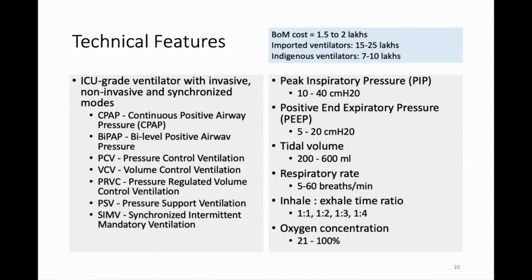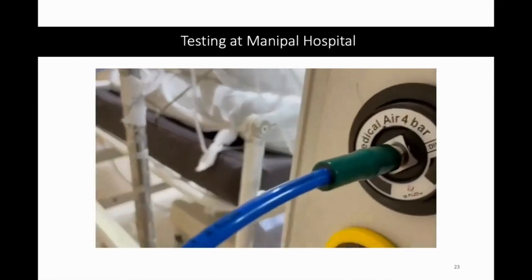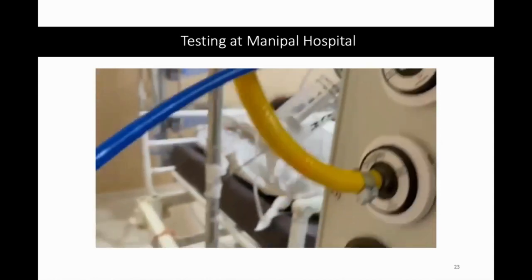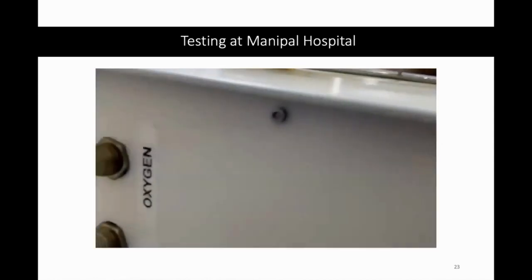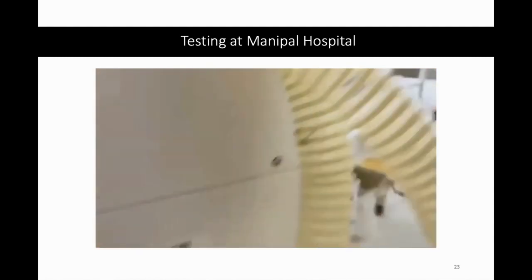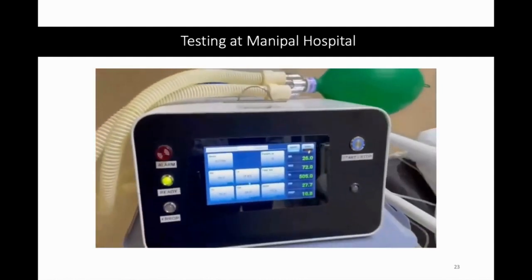That's where we stand. This is actually when the system got tested in Manipal. You see it's connected to their manifold. And yeah, so the oxygen is in there, and it's not connected to a patient here, it's just connected to their test system. They wanted to make sure it works. And yeah, sure enough, it works.